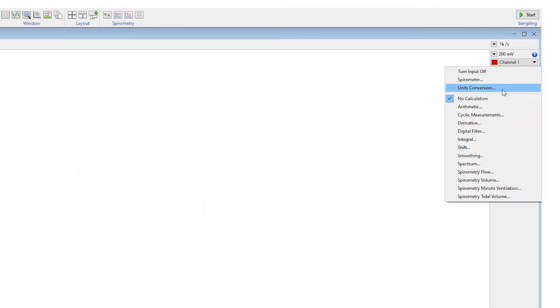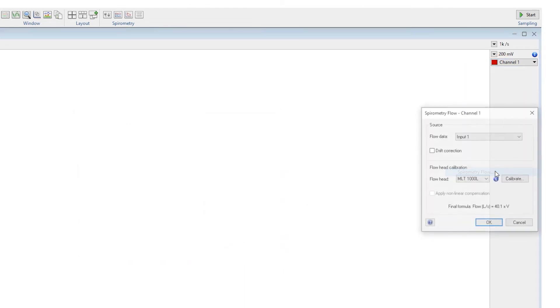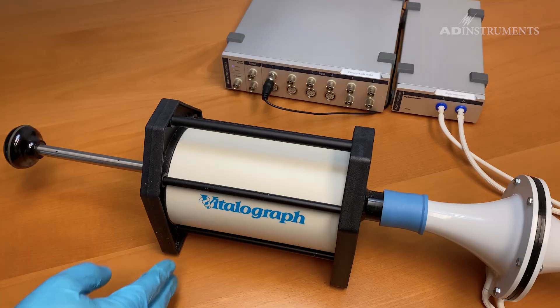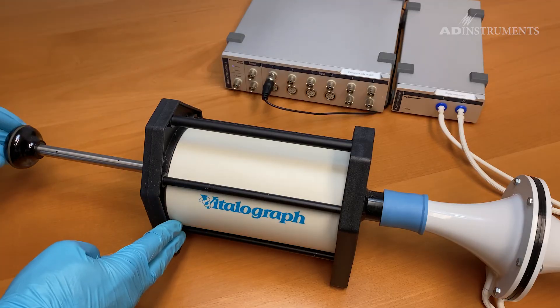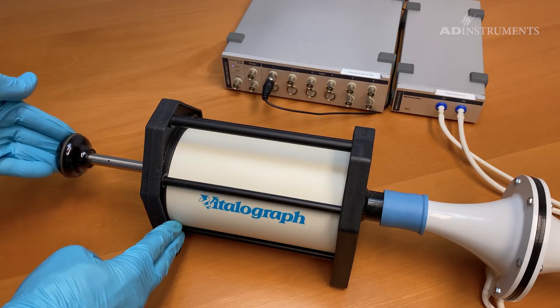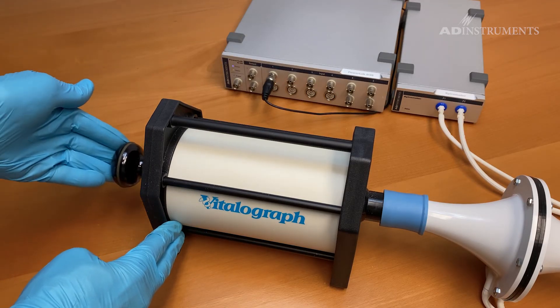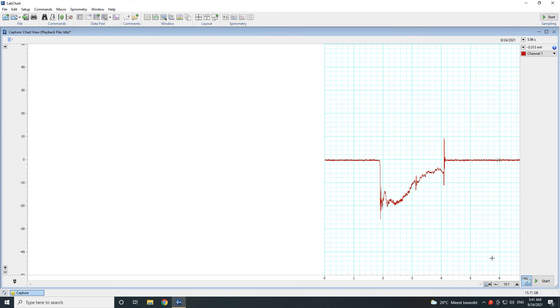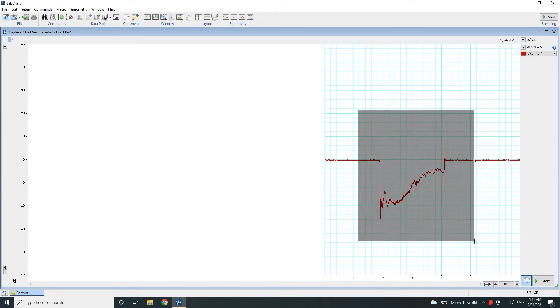You can use the spirometry extension to calibrate flow by using the preset values for various flow heads. If you do not want to use the preset value, you can calibrate manually using a calibration syringe to inject a known volume and have the extension calculate the conversion factor.